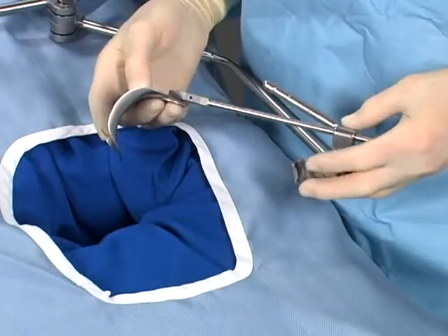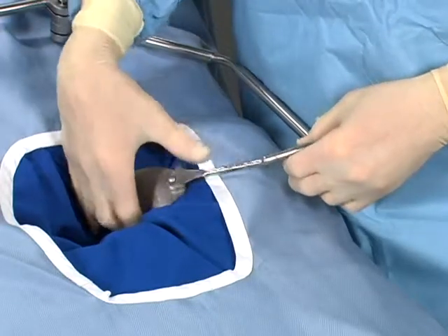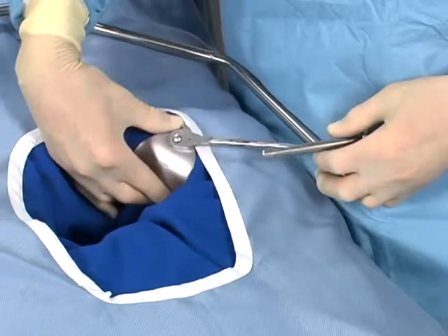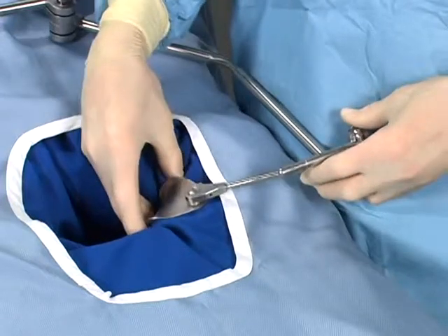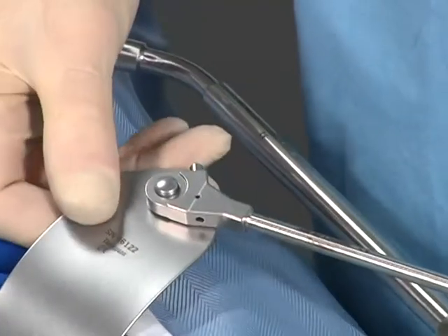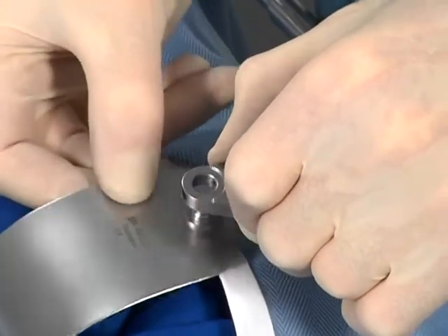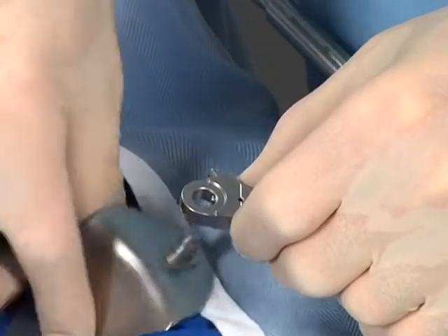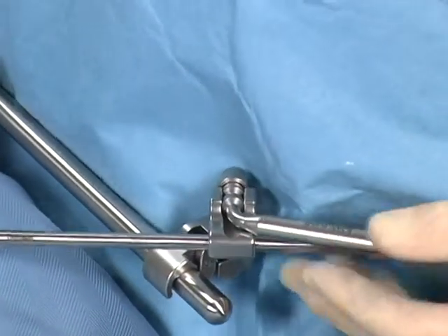Regardless of which retractor handle combination you choose, the Thompson retractor system offers uncompromised positioning of the retractor blades. All blades can be towed under and rotated for exact blade positioning. The quick and easy-to-use design makes changing blades a snap. To change retractor blades: relieve the tension on the retractor, press the release button on the interchangeable handle, and remove the current blade. Place the new blade into the incision, attach to the handle, retract and lock. It's that simple.